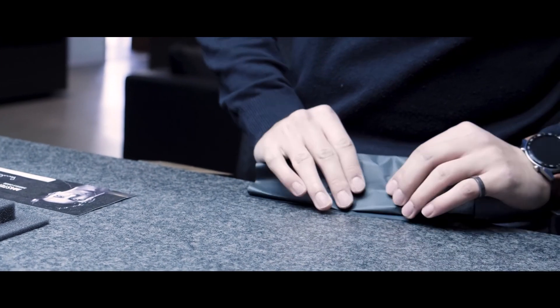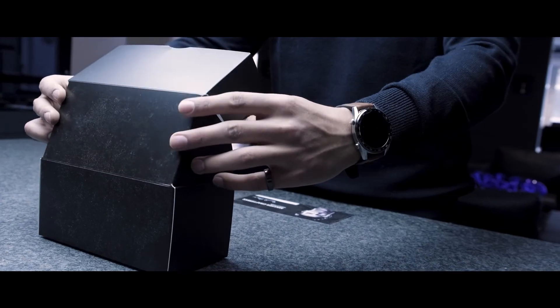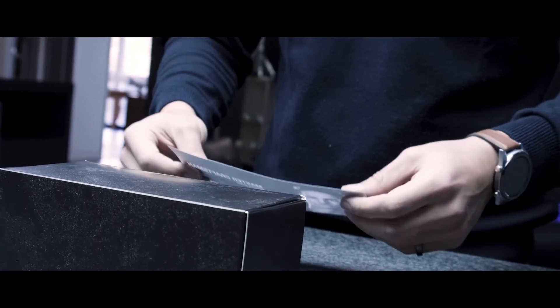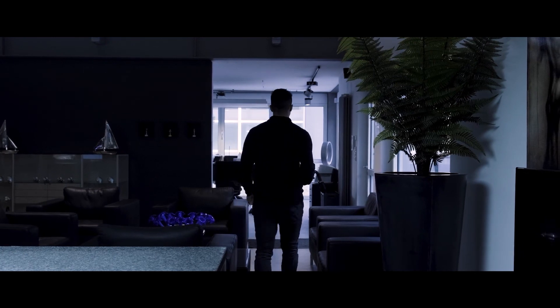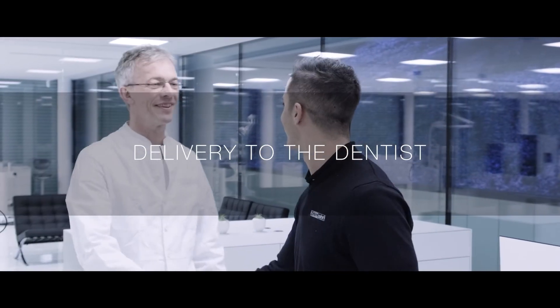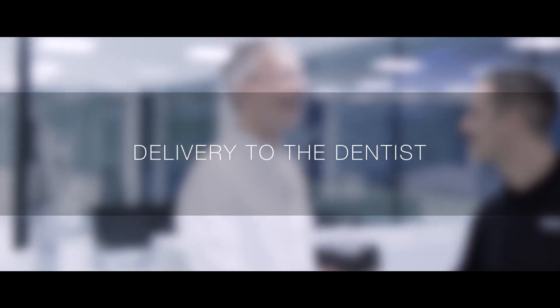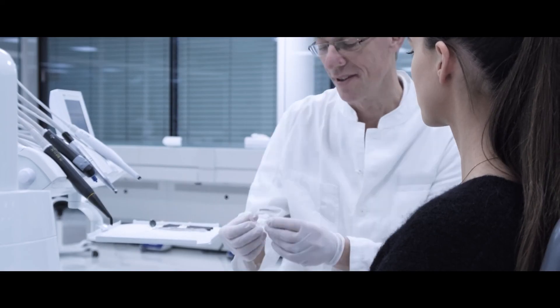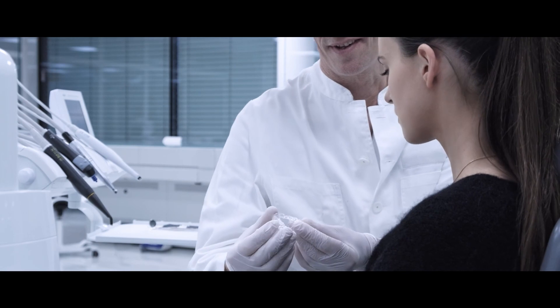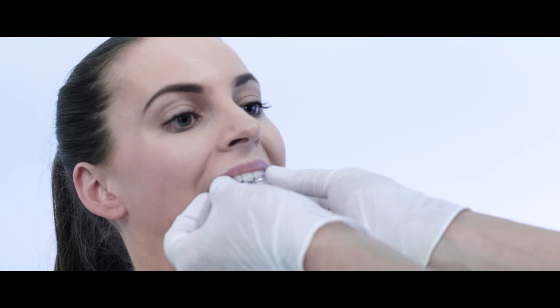To protect the restoration and deliver it in a personalized manner to the client and the patient, we insert it into a Zirconzon box. The dental technician, proud of the work done, delivers the Zirconzon box to the doctor, who proceeds with the fitting in the patient's mouth and with the final direct adjustments.